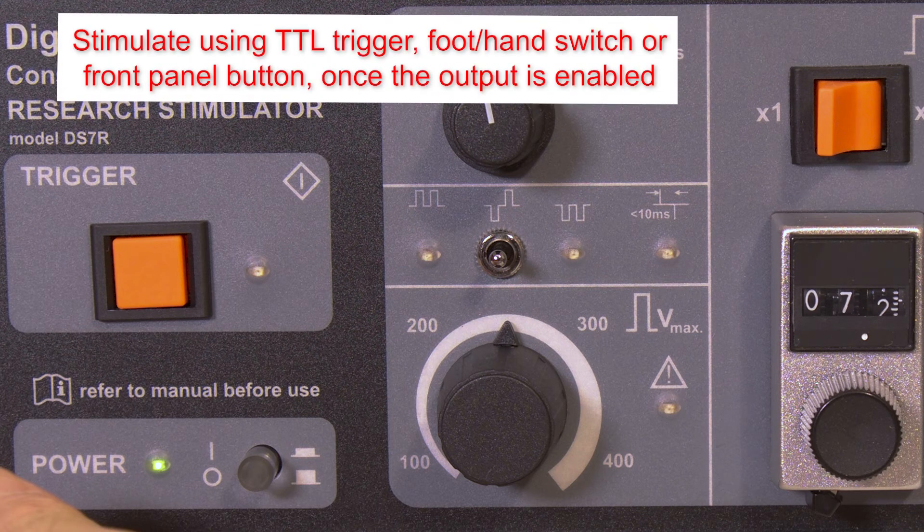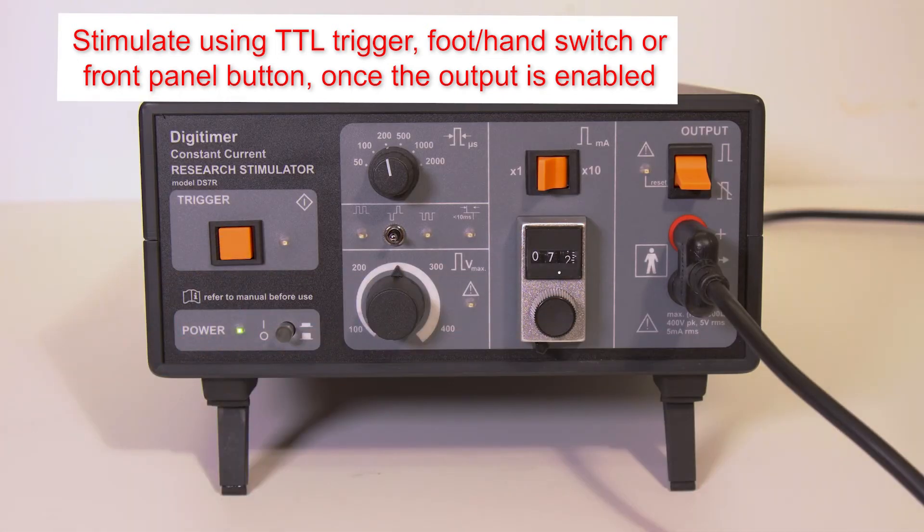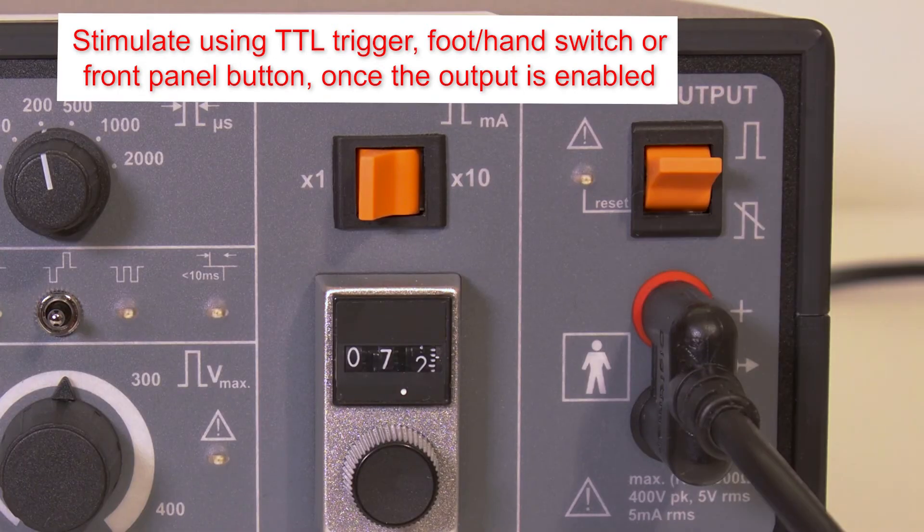Stimuli can be triggered using an external TTL pulse, a foot or hand switch, or the front panel button, but remember to enable the toggle switch before starting.